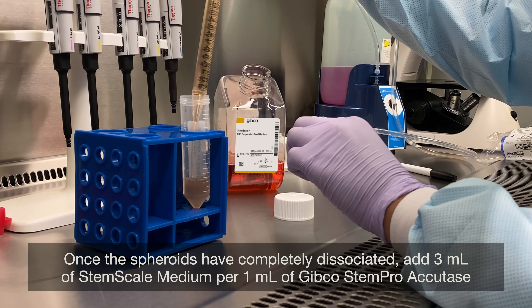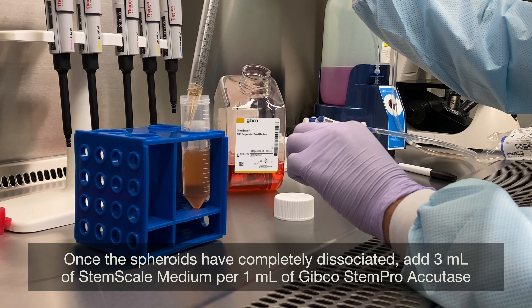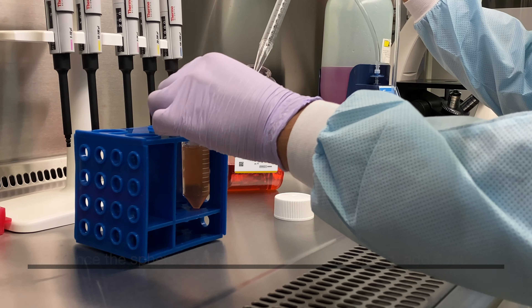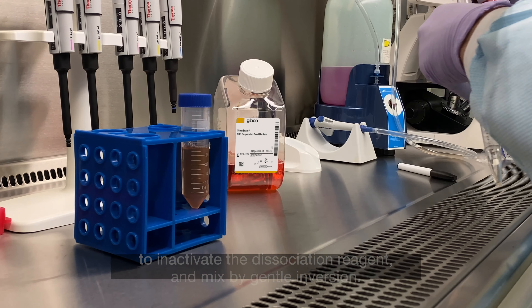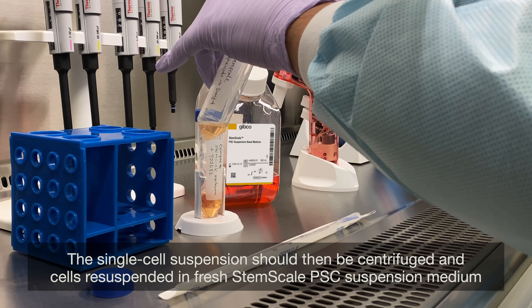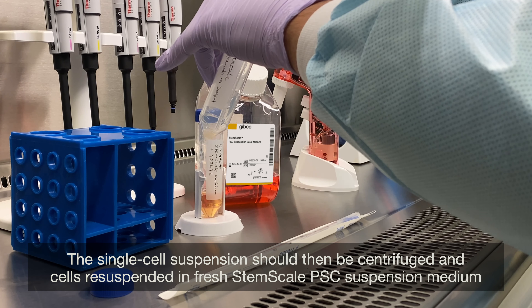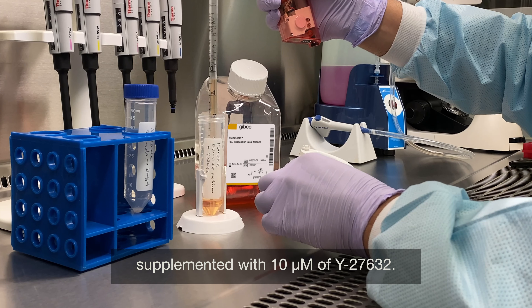Once the spheroids have completely dissociated, add 3 mL of StemScale Medium per 1 mL of Gibco StemPro Accutase to inactivate the dissociation reagent and mix by gentle inversion. The single cell suspension should then be centrifuged and cells re-suspended in fresh StemScale PSC suspension medium, supplemented with 10 micromolar of Y27632.